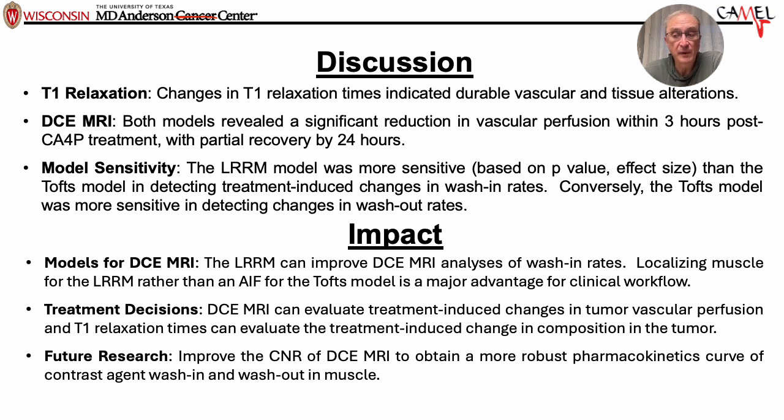And the impact of this? Well, I think most people are more interested in the wash-in rate. We don't have a long scan time in the clinic, and so it's better to look at the wash-in rate. And so we really think that the LRRM should be preferred for clinical research, or for clinical trials and clinical studies in the future.